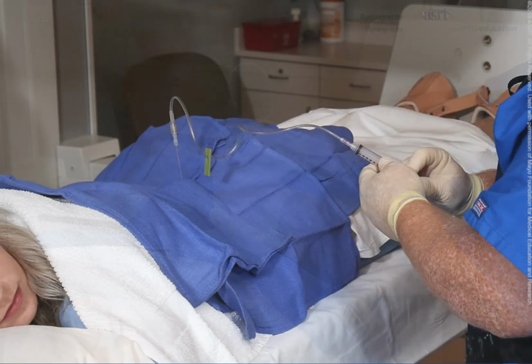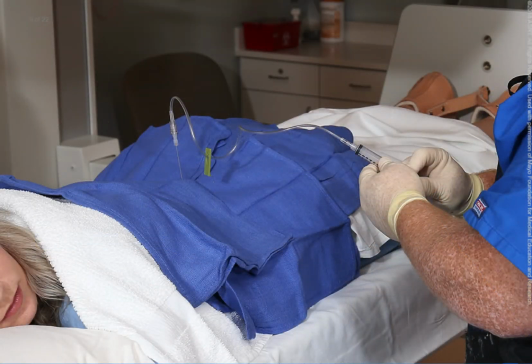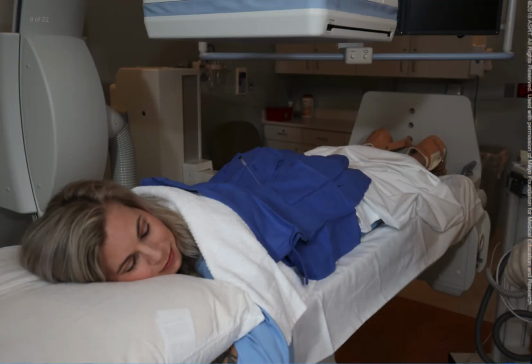Over 1 to 2 minutes, slowly instill the non-ionic, water-soluble contrast media under intermittent fluoroscopic guidance. Contrast should flow away from the needle and begin to mix with the CSF. Obtain a spot image to document needle placement. After injection, disconnect the connection tubing. Replace the stylet fully and remove the needle. Clean the antiseptic solution from the patient's skin and place a small bandage at the entry site. Secure the patient to the tabletop using the tabletop support devices.